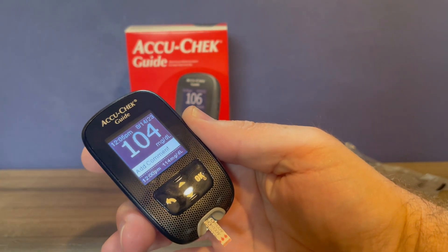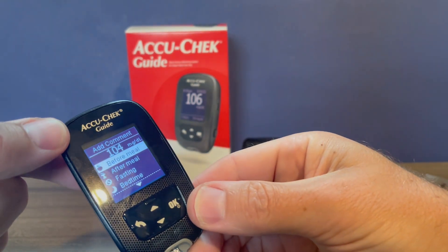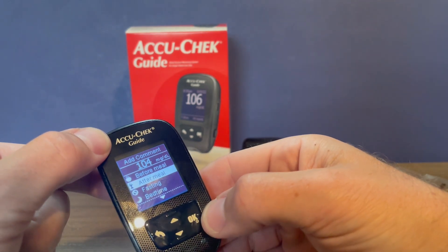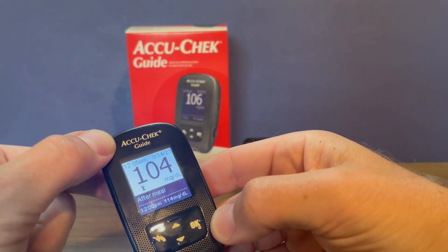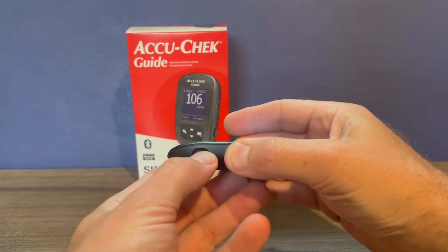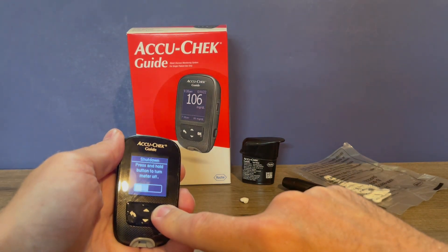There is our reading. You can just be done there, or if you want to add a comment you can press the OK button and indicate whether it was before or after you ate. This gives the reading a little more relevance — I just ate about an hour ago so I'm going to call this after meal and press OK. You can also choose before meal, fasting, or at bedtime, and then it's going to save that reading as 104 after eating. You can eject the test strip using the eject button — just push it and the test strip is easy to remove. The meter will power off on its own or you can hold down the OK button to power it off.